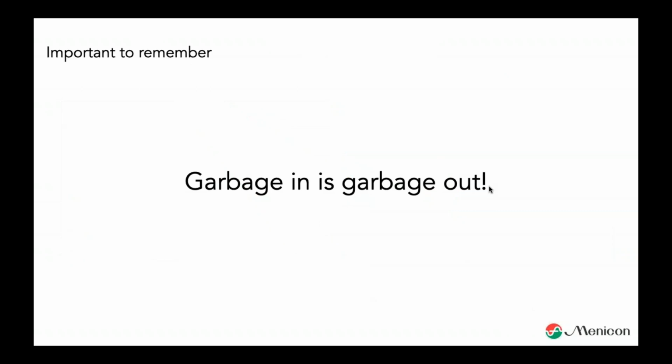Okay, another thing to remember: garbage in is garbage out. If we don't take the time and put in the effort to create a good topography image, what do you expect? Let's say you try to fit a C9 lens, which, by the way, is the Ortho K lens we have from Menicon. It's based on the new fitting philosophy from the outside to the inside. I have a much higher success rate. It's a much safer approach, but that's definitely for another topic. But it's a safer approach in Ortho K.